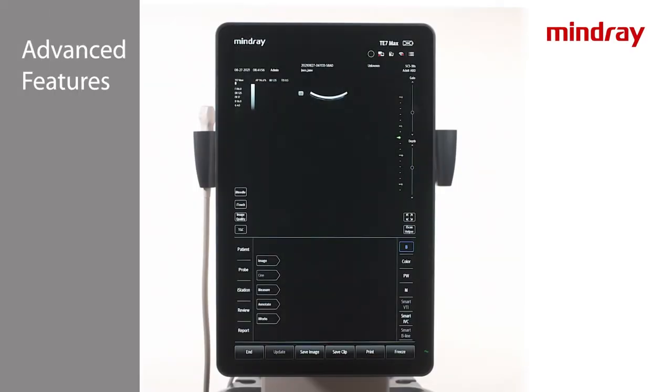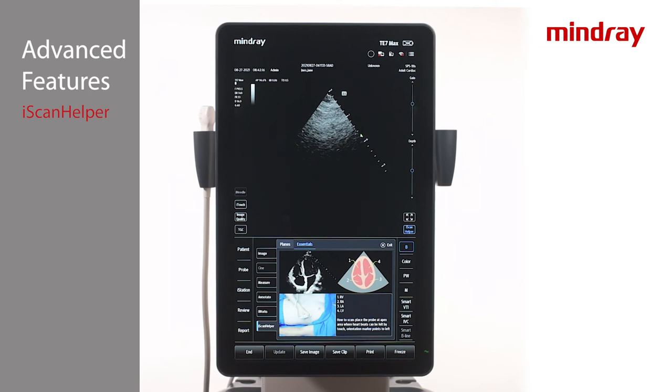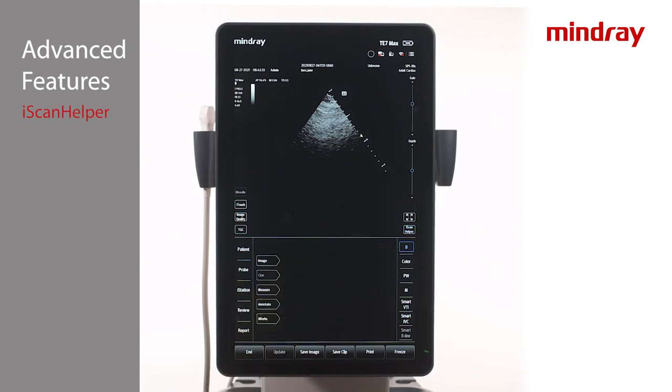iScan Helper is an educational reference tool built into the system which provides tutorials and is exam mode specific. To initiate iScan Helper, select the desired transducer and exam mode, then tap the iScan Helper icon on the touch screen. Select the target view and the system will display four different informational screens, providing proper transducer placement, desired ultrasound image, a graphic pictorial, and additional scanning tips. Tap the iScan Helper icon to exit. Please note that images cannot be saved while iScan Helper is active.